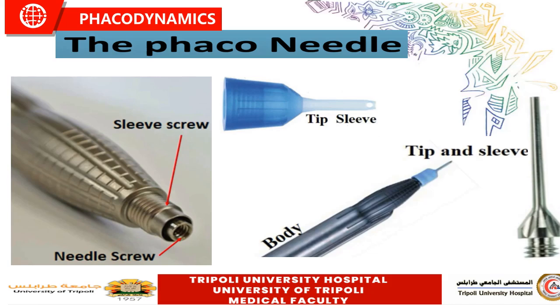In the next slides, we will speak about the heat generation of this Phaco needle and the measures done to avoid the complications of the high temperature of the Phaco needle, like the wound burn. So the silicone sleeve is very important. The Phaco needle should be covered with the silicone sleeve. However, as you know, the innovations of the microincision cataract surgery and the advancement in the power modulation make the Phaco emulsification a cold procedure. So in bimanual Phaco, we don't use the Phaco sleeve because there is no heat production. So we can use the Phaco needle without the Phaco sleeve.